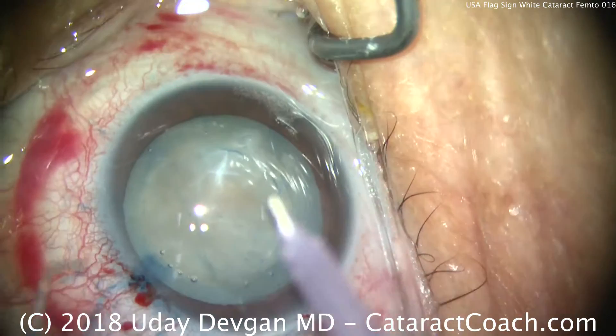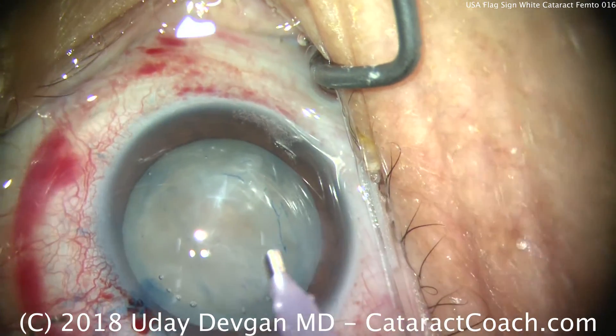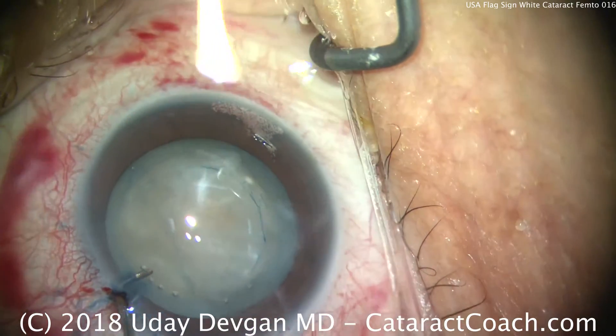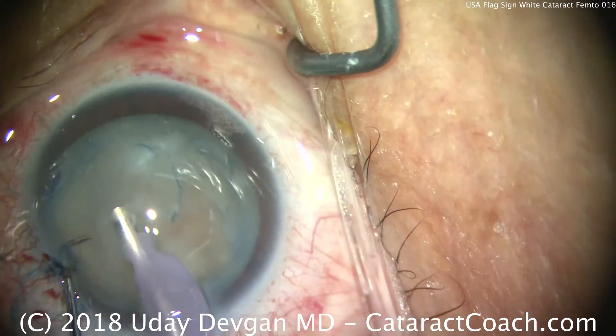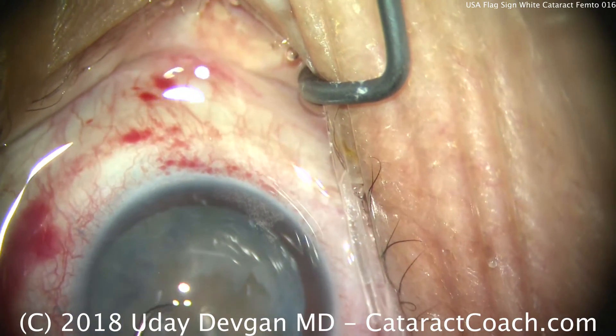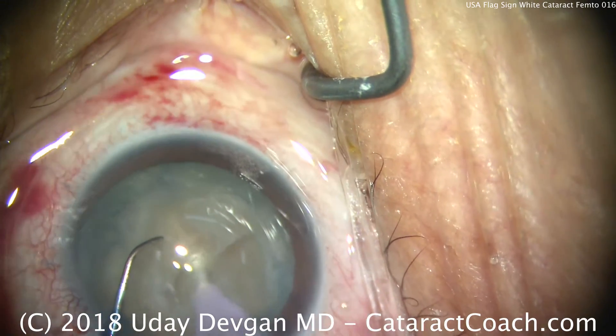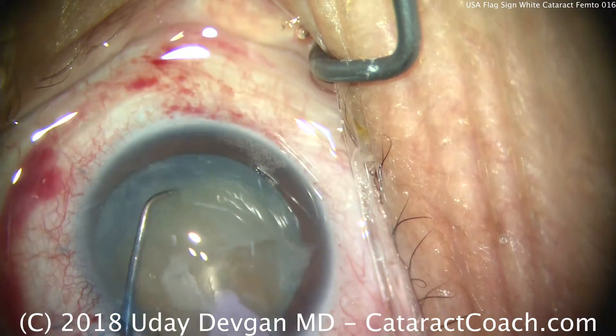Now we're ready for our phacoprobe. By having the laser do the capsulotomy for us, it really does save time. We'll clean up some of this residual cortex, buzz in with the phacoprobe, dig in the chopper, and try to chop this nucleus into pieces around the equator.